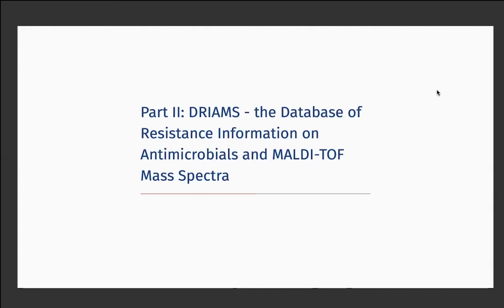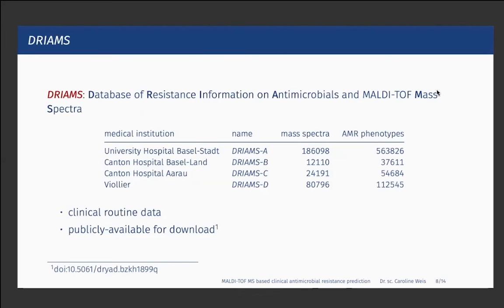So with that foundation, we move into the second part of the talk, which introduces a new data set collected specifically for this purpose. So we curated a data set tailored for MALDI-TOF MS-based antimicrobial resistance prediction, which is several orders of magnitude larger than any previous data set. We labeled this data set DRIAMS, the database of resistance information on antimicrobials and MALDI-TOF mass spectra.